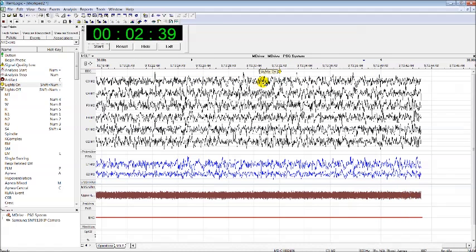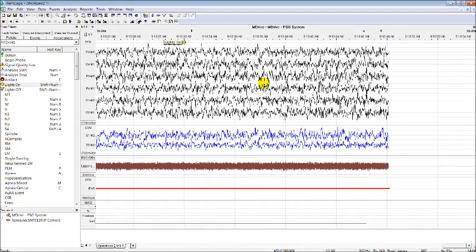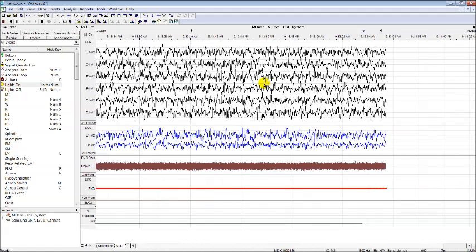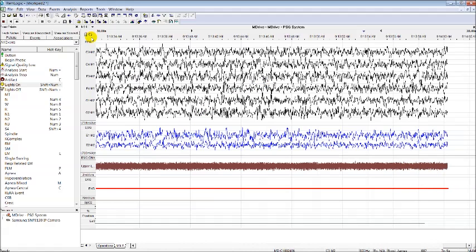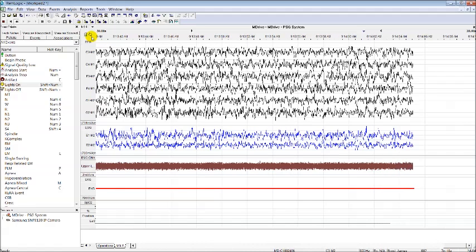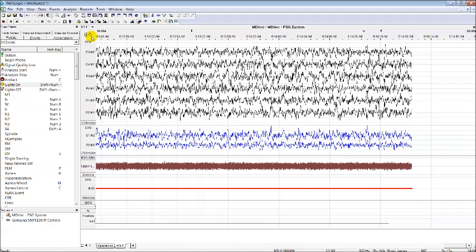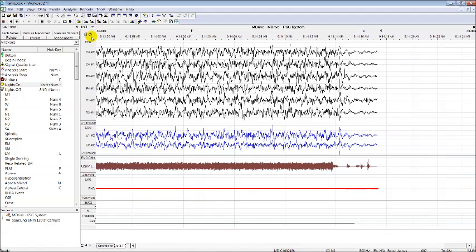Okay, so this is the time that we will ask the patient to stay awake for 2 hours and to stay away from the bed. Do note that you do not stop this recording. As you can see, this arrow here is still turning, still running, which means just let it run until the patient comes back 2 hours later for the second nap. Basically, with all the leads still connected to the patient, you can just disconnect the head box. I'm going to show it to you now.